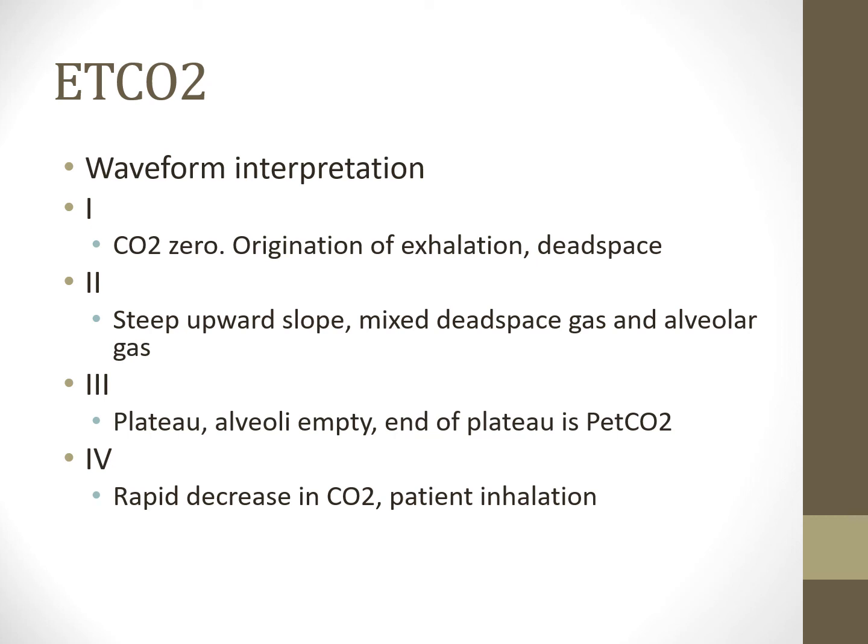If you do not see a flat phase 3, that is a sign that there's poor alveolar ventilation. I will repeat that again. If phase 3 is not a plateau, that means the alveoli are not being ventilated. So with severe bronchospasm, you'll see a shark fin waveform. You won't see a plateau, and that's a sign of very poor alveolar ventilation. So you need to see an alveolar plateau, and at the end of the plateau is where the end-tidal CO2 measurement is taken. So the very end of it, and we'll look at the waveform here in a second.